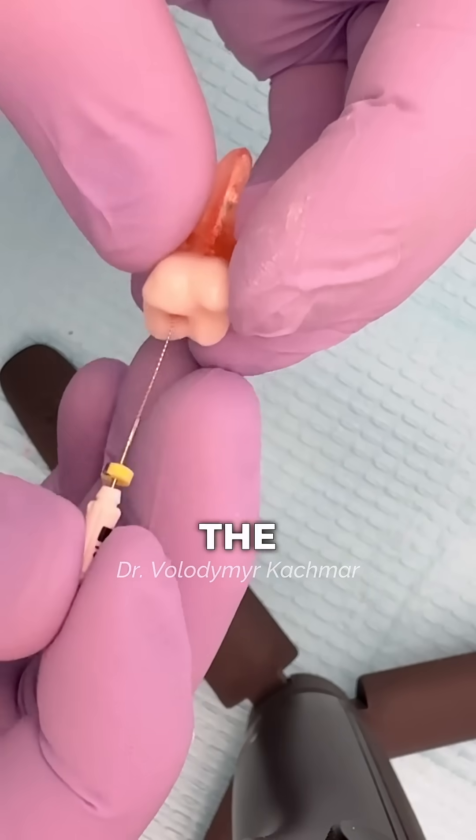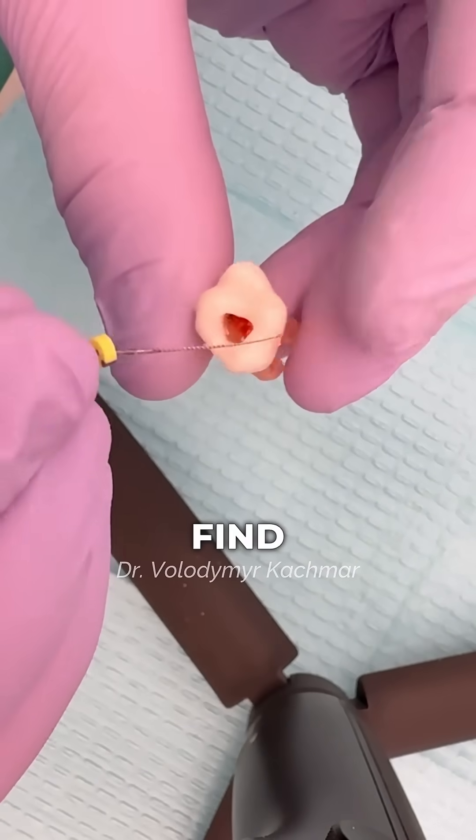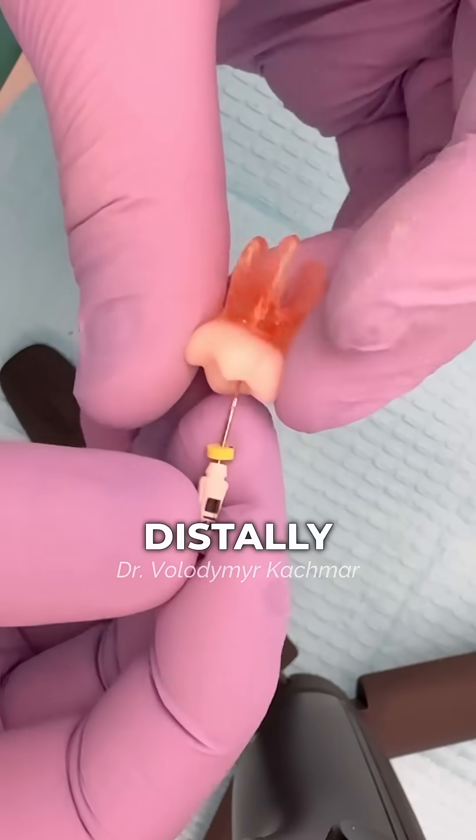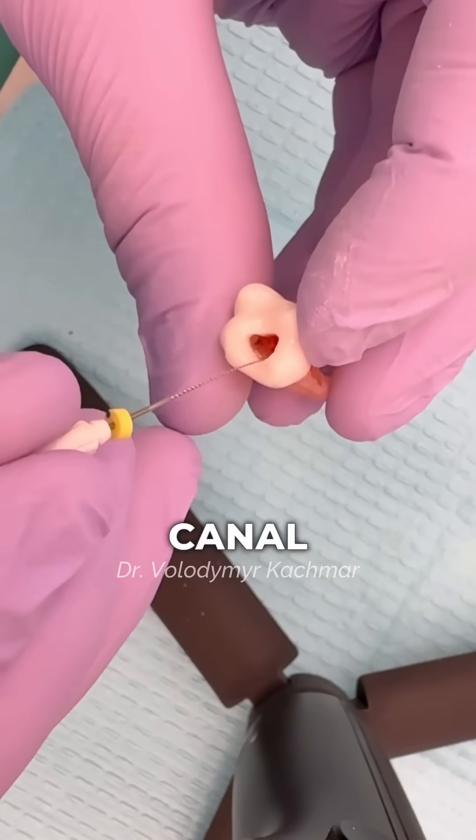Third, locate the canals. I recommend starting with the palatal canal, since it's the widest and easiest to find. From there, move buccally and distally to locate the DB canal, and buccally and mesially to locate the MB1 canal.